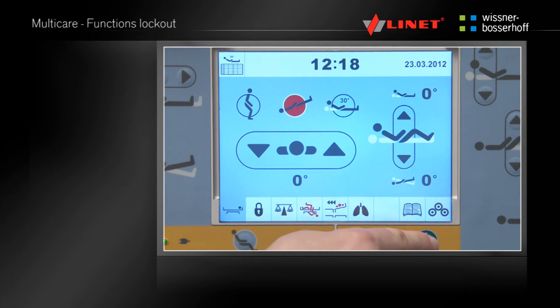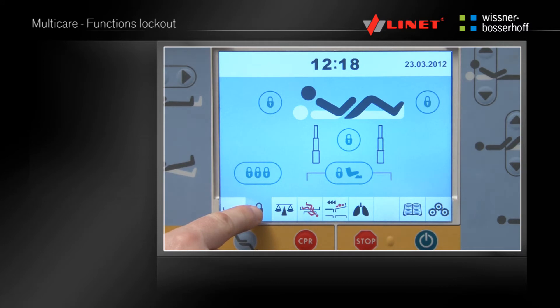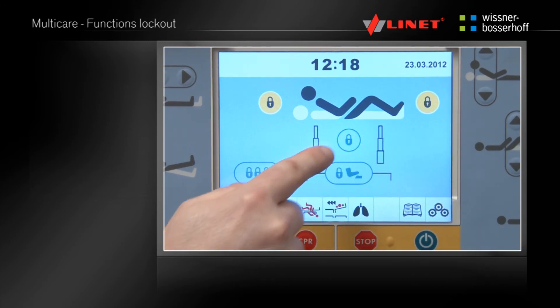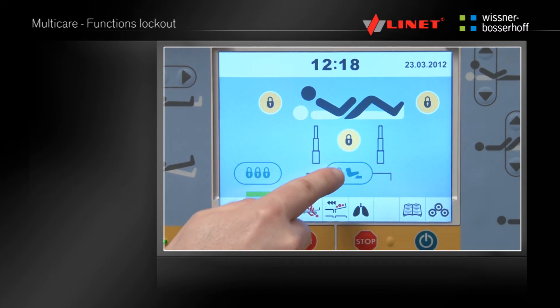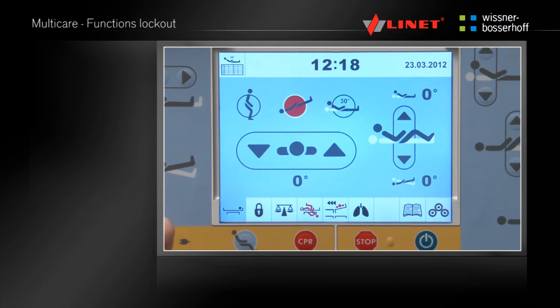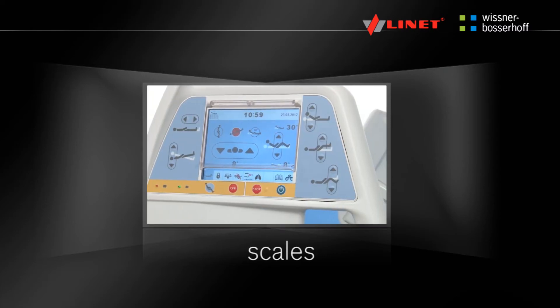Multiboard function lockout. Press the Activation Go button. By pressing the respective button the function locks menu can be accessed. The lock buttons will lock respective functions one at a time or all at once. When the lock is activated the respective function light indicator is lit.